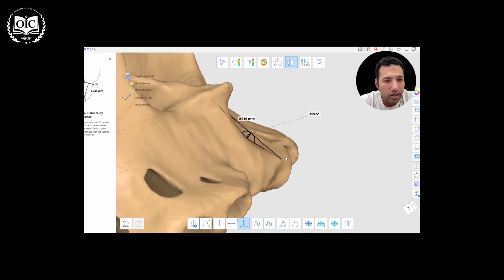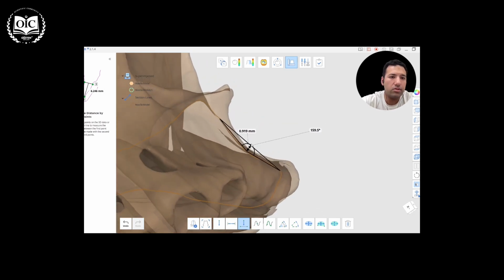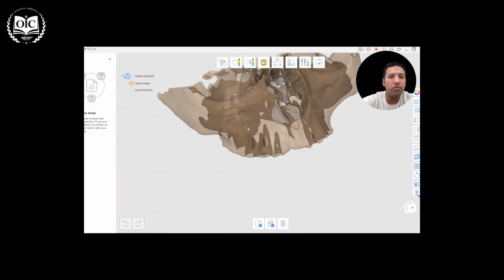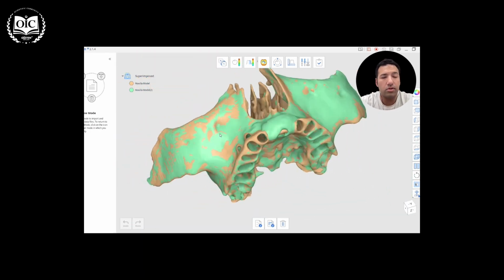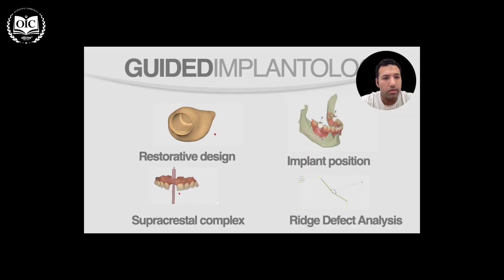Is it a deep one, an easy one to reconstruct with collagen membranes, for example, or is it a flat defect where we need a more rigid membrane, or more overfilling with a harder material to get the result that we need? After this analysis, we determine the material of choice that we're going to use, bone or membrane. Then we implement this plan accordingly to serve the purpose.